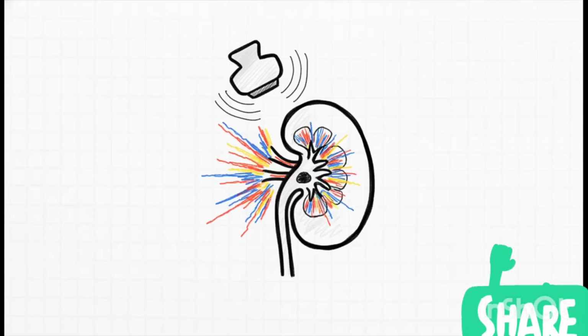But what if a stone is incredibly small? It might be really hard to see that bright spot or the shadow. Well, sonographers have a brilliant trick for this. By turning on a feature called color Doppler, small stones will often demonstrate what's known as a twinkling artifact. Instead of a shadow, the ultrasound displays this rapid, alternating splash of color right where the tiny stone is hiding. This vastly improves detection and helps catch stones that might otherwise be completely invisible.